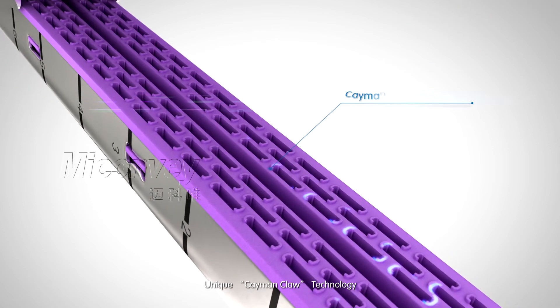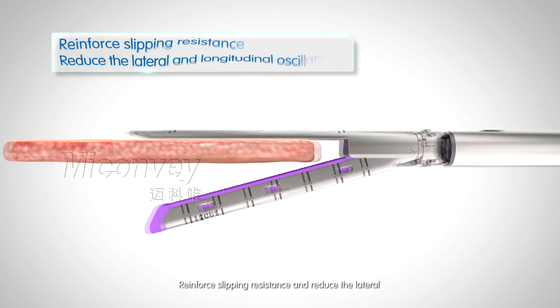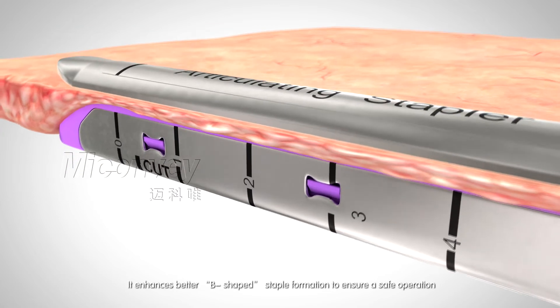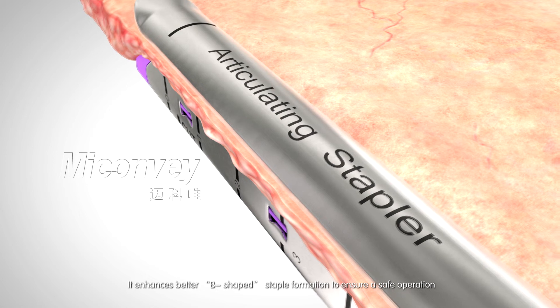Unique Cayman Claw Technology. Reinforces slipping resistance and reduces the lateral and longitudinal oscillations when the staples are lifted. It enhances better B-shaped staple formation to ensure a safe operation.